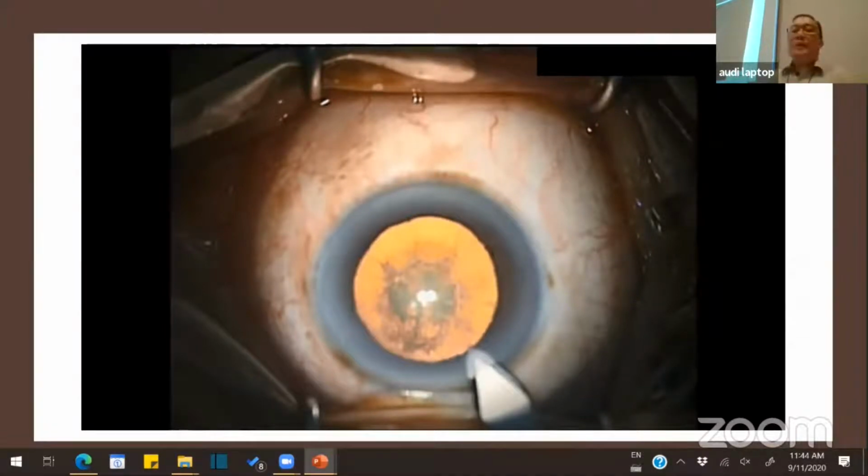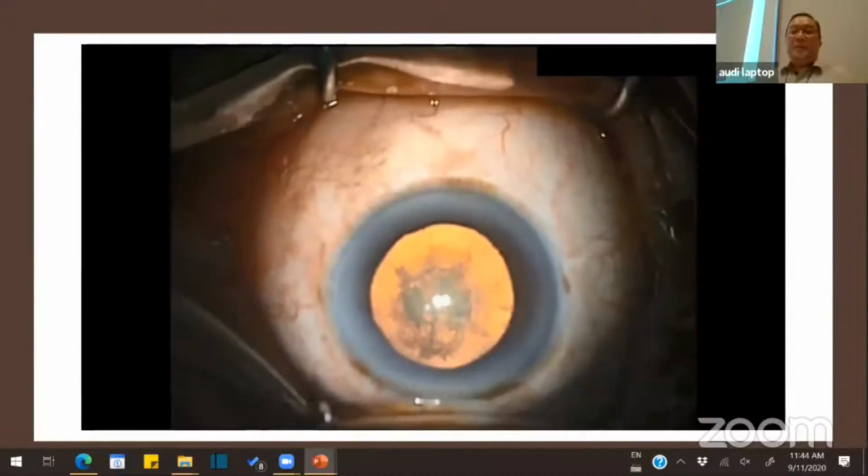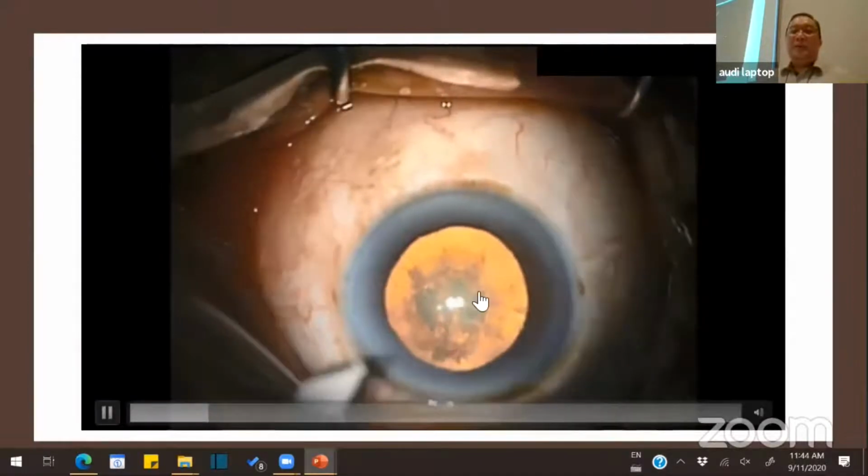So normally when trainees come to me, I would just say choose between the two, which one you're okay with. And I will just explain to them the justification behind the steps, and they choose themselves. Right? And this is how I do. I hold it there to stabilize the eye. So it's 2 steps. This is all topical only, right?